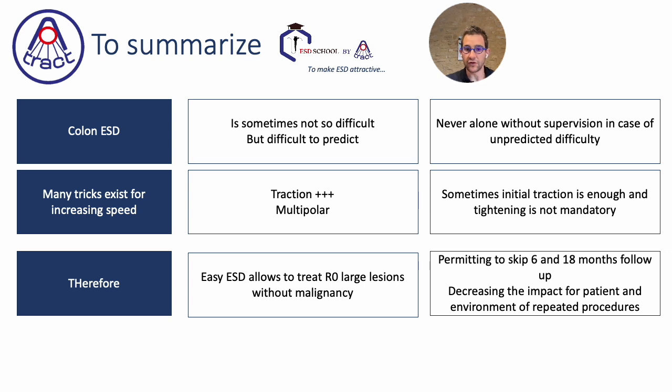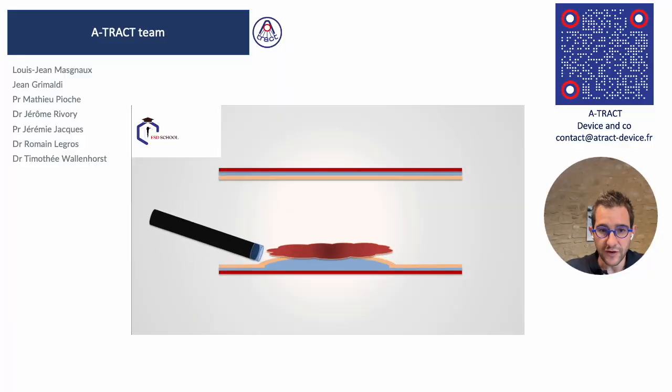So ESD is a good way to reduce the follow-up, but it should be a quick procedure. If it takes 3 hours and you can treat only one patient instead of 4 by PEMR, piecemeal EMR, it's not a good idea.